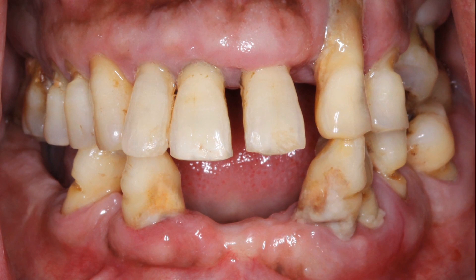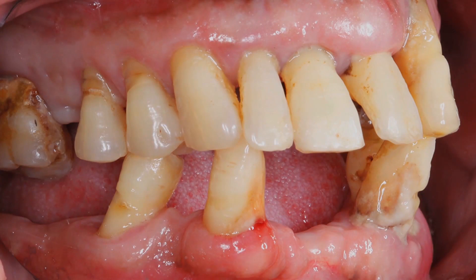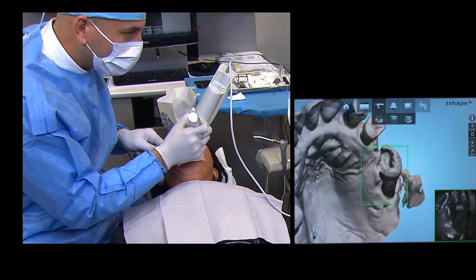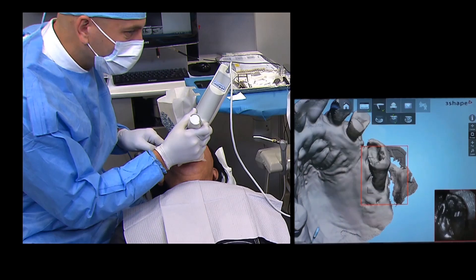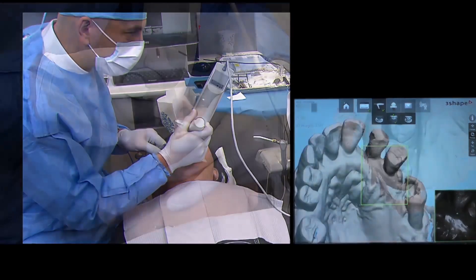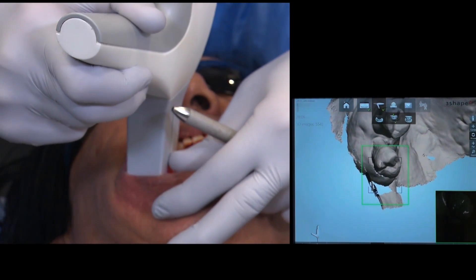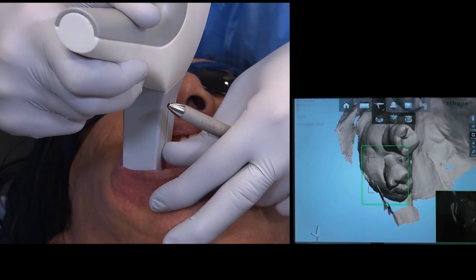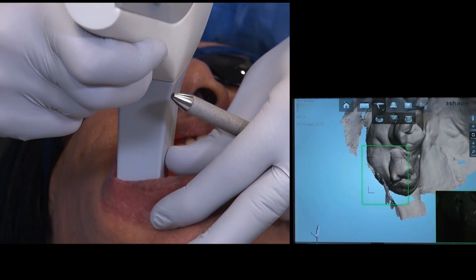As you can see in these pre-op pictures, the patient presents with very poor oral hygiene and is diagnosed with generalized chronic periodontitis. I brought him in wanting to showcase a digital impression for the initial impression making, because with a regular alginate impression, the teeth are at risk of being extracted at the time of impression making. So I utilized a Trios 3Shape intraoral scanner.